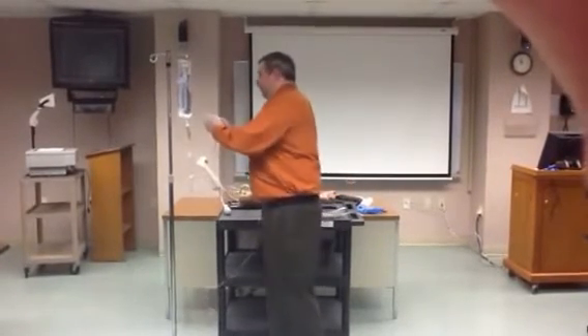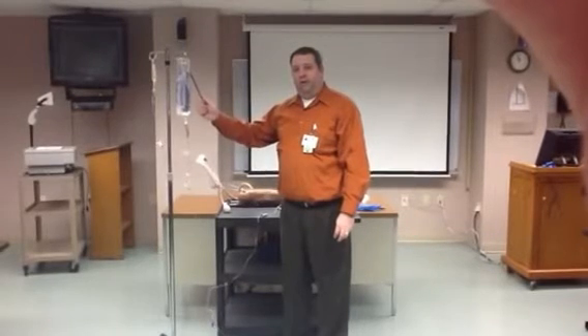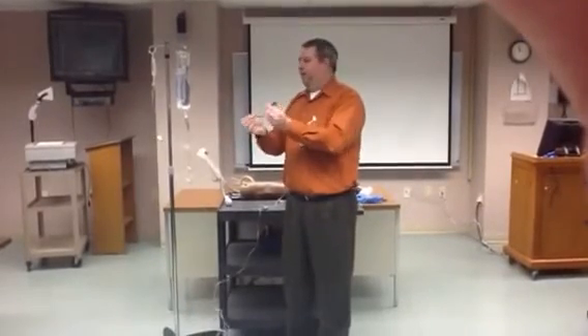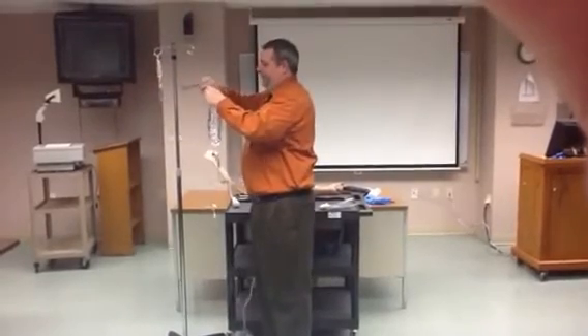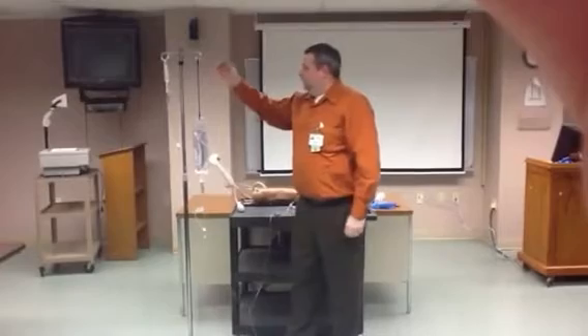Now we're going to take this and hang it on the pole. Remember, if these are both equal, whatever has more fluid in it is going to run. We don't want the primary fluid to run — we want the secondary fluid to run. So we're going to take our blue hook and lower our primary tubing. Now secondary is higher than the primary. When I open this up, the secondary will run.